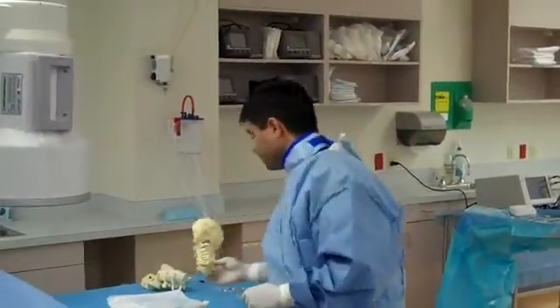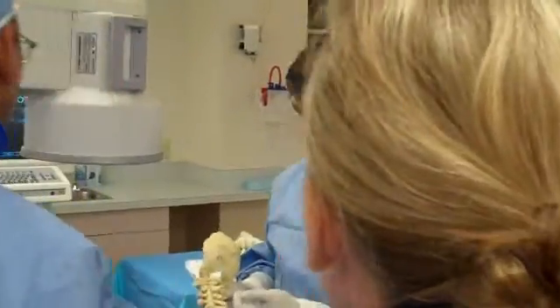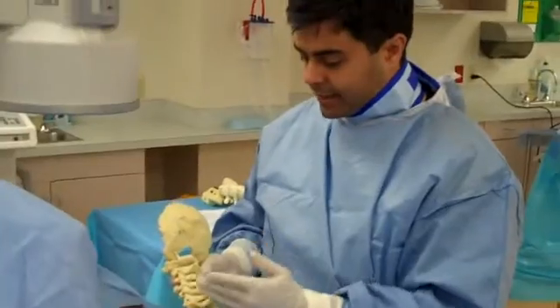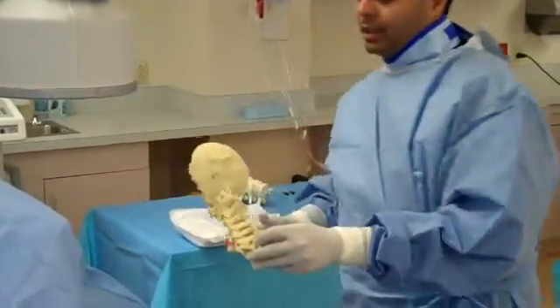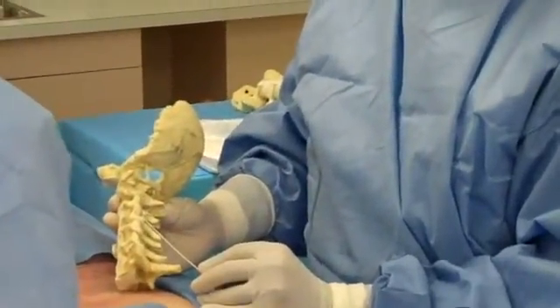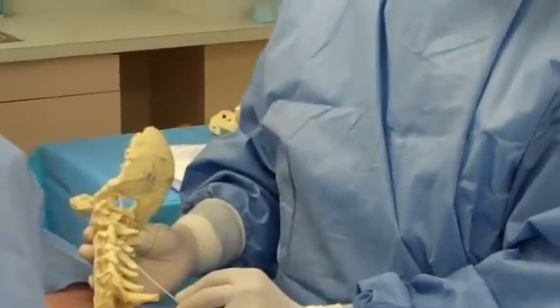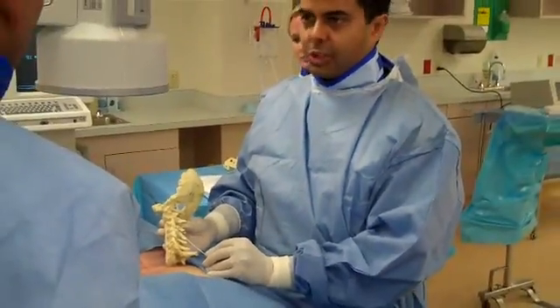You're going to be looking for the lateral mass. Here's our structure — this is the lateral mass and the articular pillars. Essentially, what we're trying to do with the needle is use an approach where, when you take a lateral view, it ends up somewhere in the middle of the actual articular pillar of the lateral mass. So this is where our final needle position is going to be.